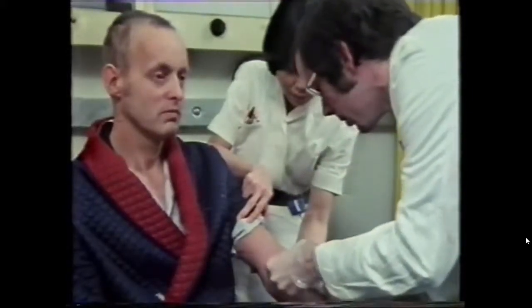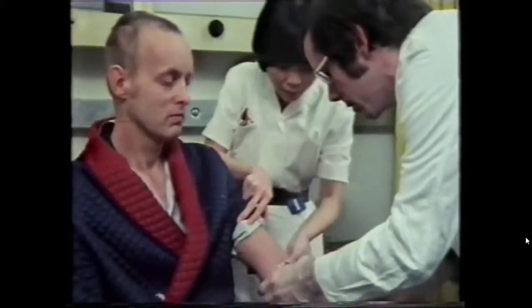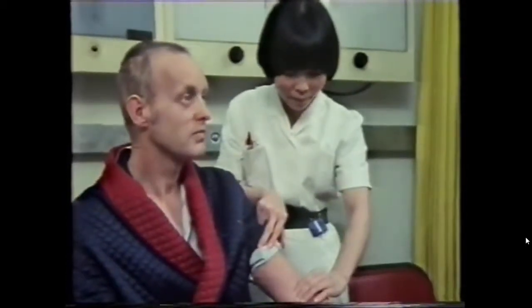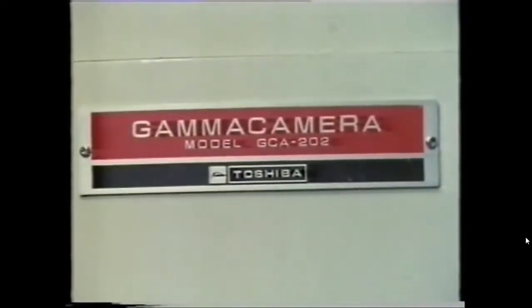To find out if this man's liver is working normally, he's injected with a radioactive solution. The gamma rays pass through his flesh and are then detected by a special camera that shows which parts of his liver are working.